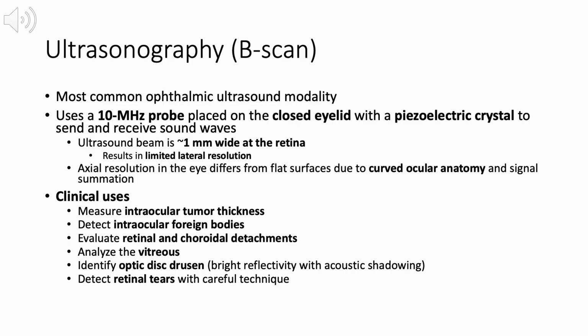It is used to measure intraocular tumor thickness, detect intraocular foreign bodies, and evaluate retinal and choroidal detachments. It is also useful for analyzing vitreous pathology, identifying optic disc drusen based on their characteristic bright reflectivity with acoustic shadowing, and with careful technique, detecting retinal tears.